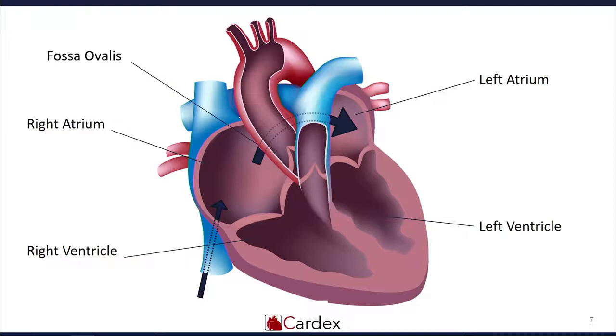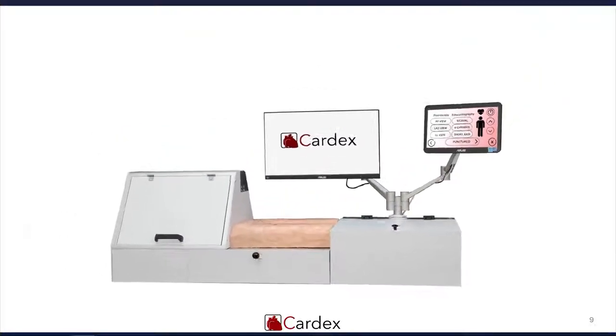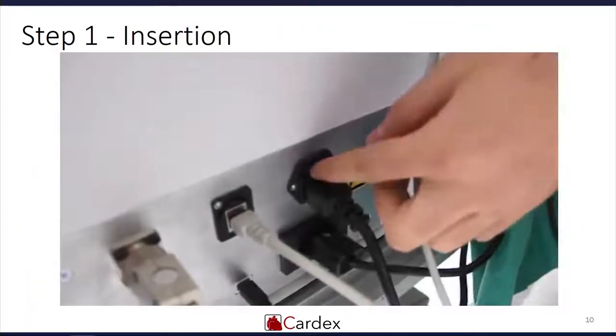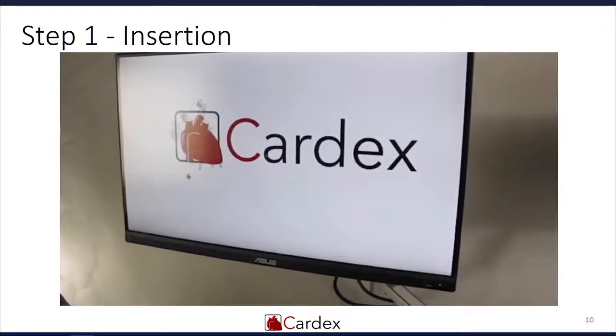To fully understand the operation, we observed surgeons at the operating theater, defined our user's needs, and then started to build our first prototype in November. Today, we are proud to show you our final result, our simulator. After the welcome screen, you can start the simulator by only pressing one simple button. The first step is to achieve access to the veins at the groin. After having identified the correct spot, a hollow needle is inserted.